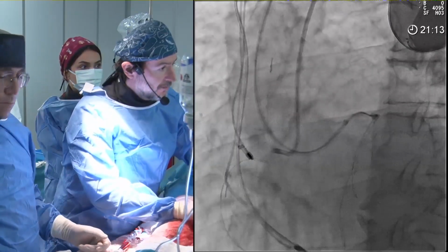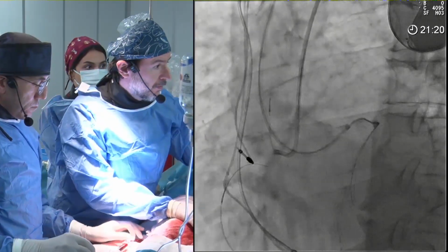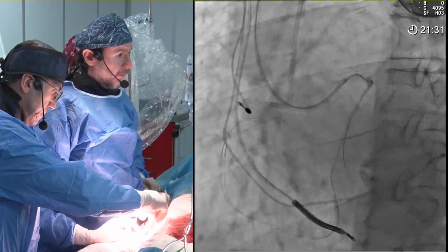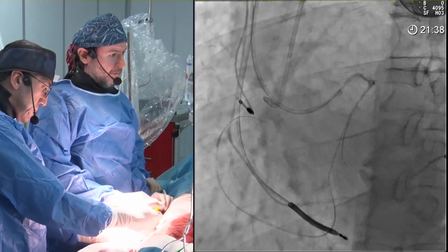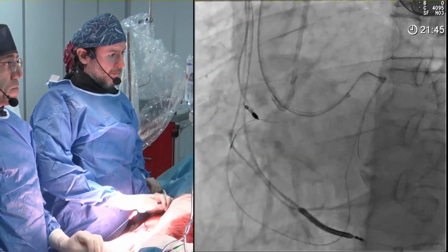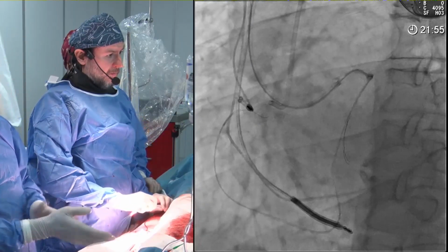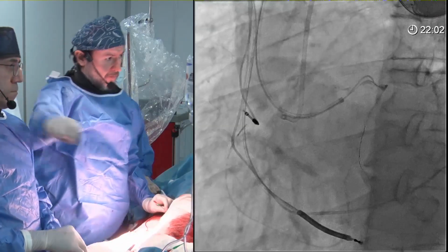So I think it's better to take time and spend time finding the loosest part with a safer wire. I think a Rad-Judkins guiding would help more, because Rad-Judkins could be easier to engage the ostium. We don't need any support, because obviously it will be difficult to puncture antegradely, but at least we have to make sure where the ostium of the RCA is, because we are blind here. Yeah. We have to have some targets somehow. Totally agree with you. I think CT angio is extremely important in this scenario, but at least we can see how much calcification we have, or if we have any calcification at the ostium. I think it will be a great help.